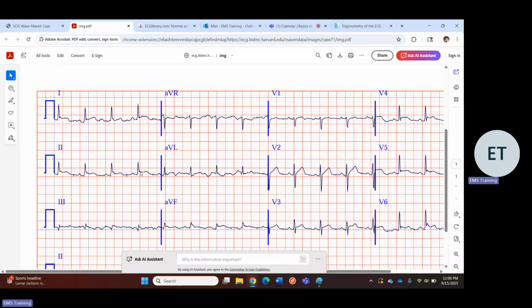I would try to get a cleaner EKG tracing, to be honest with you. And is there really ST elevation everywhere? But the flat appearance of this is concerning. I don't like flat ST segments. They should smiley face and cove up typically. And there's global T wave abnormalities, they're flat, flat, flat, especially in this lateral section.